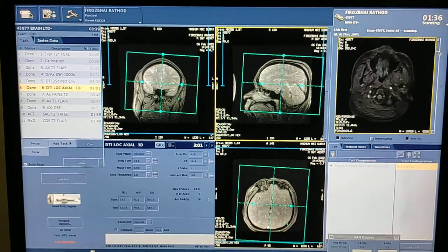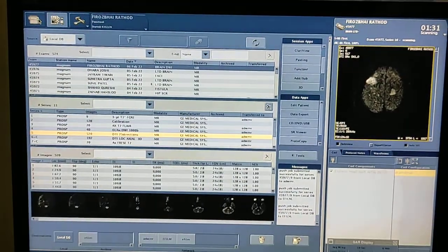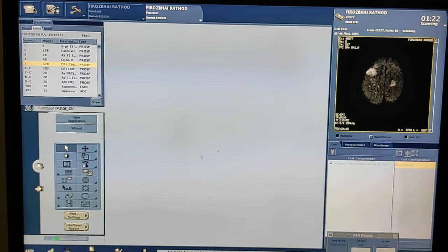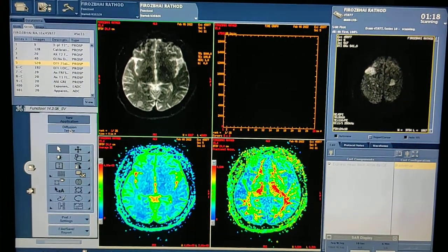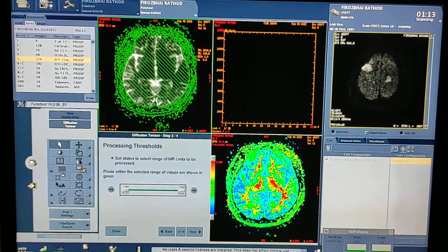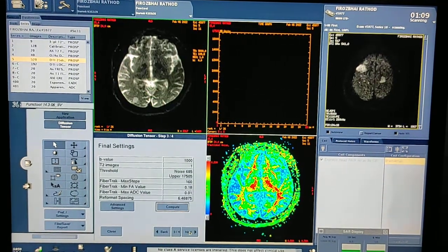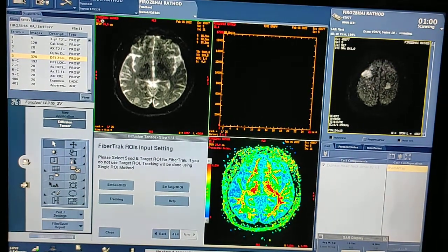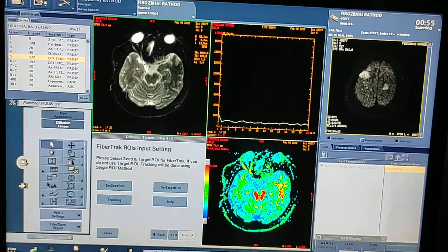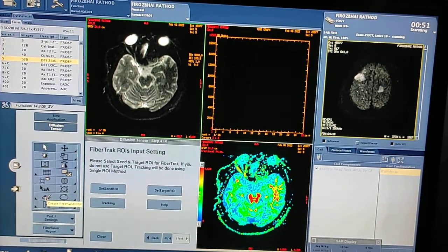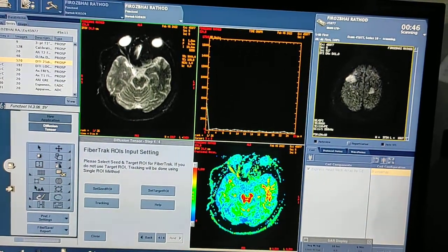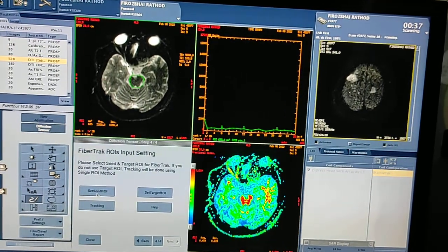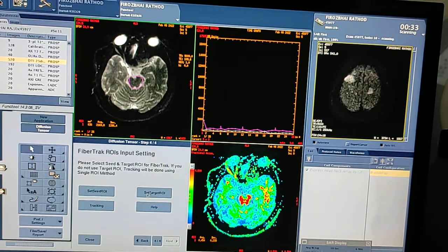DTI images have been displayed. Click on the raw data, select the DTI images, then click on Func Tool, then click on Diffusion Tensor. Next — reduce the noise slightly — then next, then next again. Now you have to draw the ROI on whichever track you want. Select 'Create Freehand ROI', click and draw the region. Then click 'Set Seed', 'Set Target', and click on Tracking.